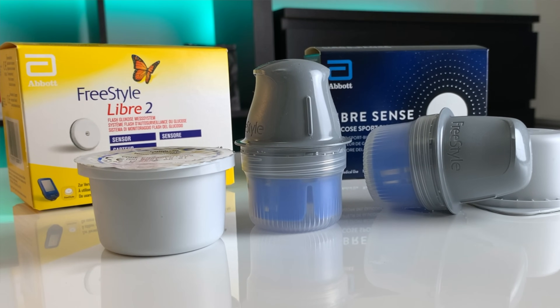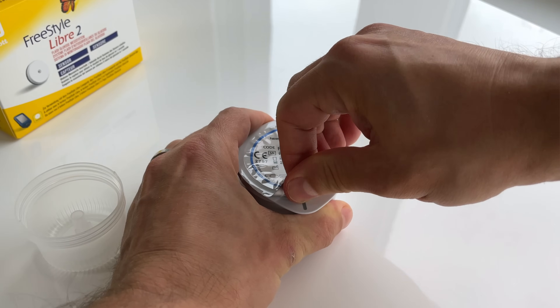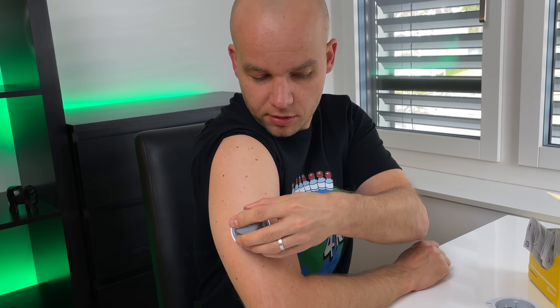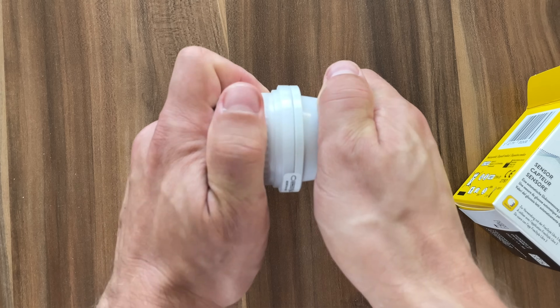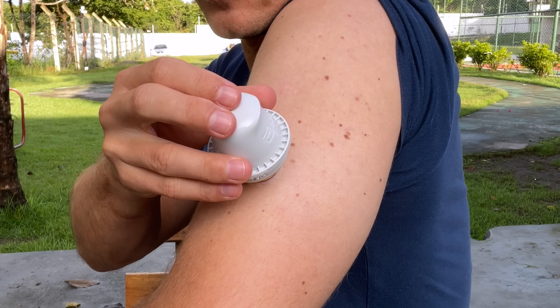Speaking of sensor application, there's another slight difference, number 11, between Libre 3 and all other sensors. The older models come in two separate pieces — one is the applicator and the other is the sensor itself. You need to line them up and press down firmly on the applicator, ideally on a hard flat surface, which loads the applicator with the actual glucose sensor. You then lift the applicator and place it over the site and push down firmly to apply it. Freestyle Libre 3's applicator is already loaded in the package — once you unscrew the cap, you can apply it right away, making the whole process a bit faster and easier.